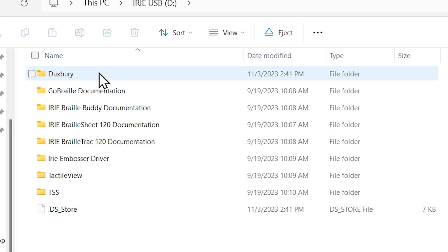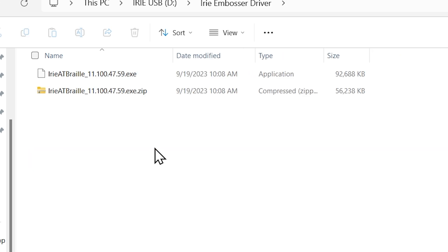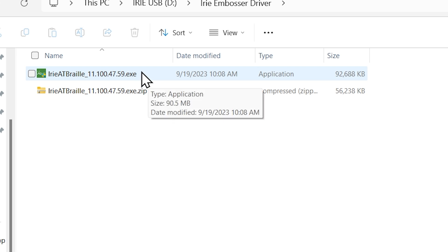Now you'll notice within here I have a few different options. We've got the different pieces of software that I mentioned, as well as our embosser driver, and that's what we're going to want to install today. So I'm going to open that folder up, then you're going to locate the Irie AT Braille.exe file in there. It's an executable file and we're going to go ahead and select that file and open it.